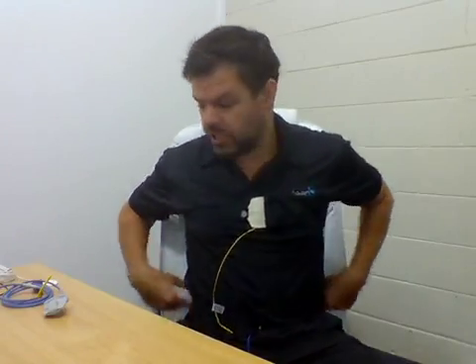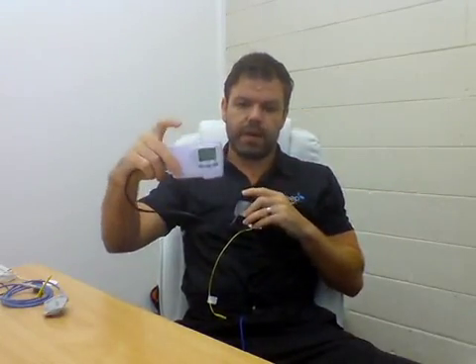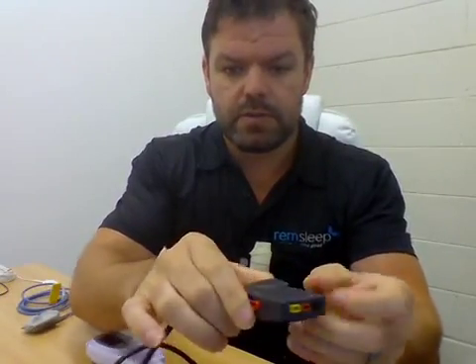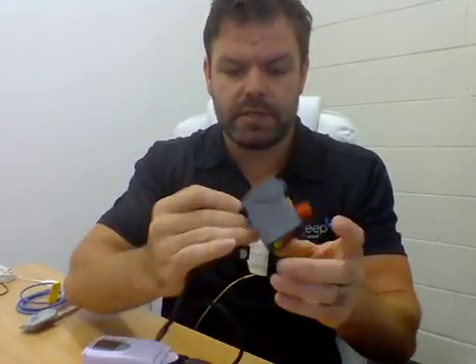Now these bands also act for the next stage, which is step 2, and that's attaching our input box and recorder that we have in the pack. This part here is what we call the recorder. It does what it says, which is record all the sleep information, and this box is the input box. As you can see, it has a number of inputs, and they're all different colors. And there's 2 shapes. There's the round shape and the keyhole shape. But they're all color-coded, which makes it very easy doing this.